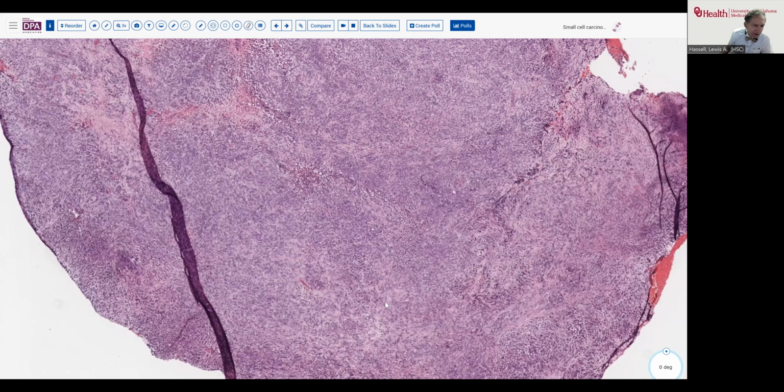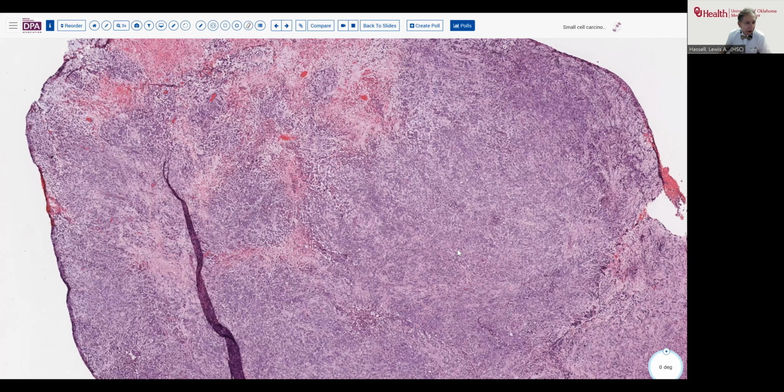Now, in this situation, this did not always stain exactly like her initial biopsy had. And we ended up attributing that to the chemotherapy effect. But I think that's an important point to remember, that once you've begun to administer chemotherapy, that can alter the immunohistochemical backdrop in which you're operating. So we'll close with a couple of caveats here.